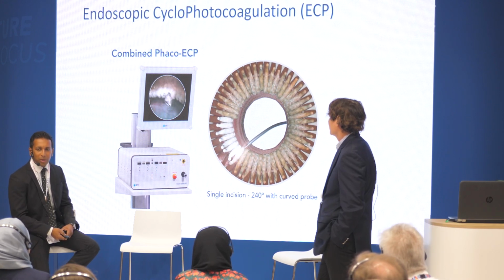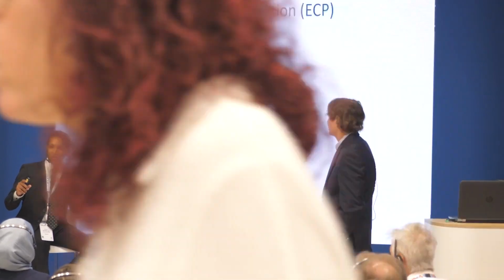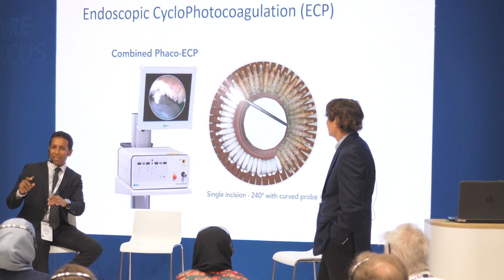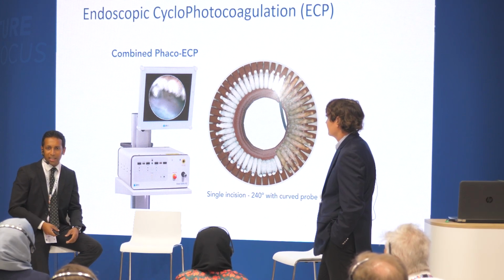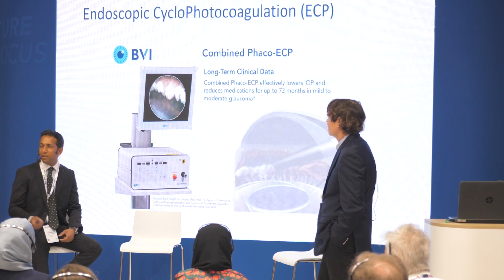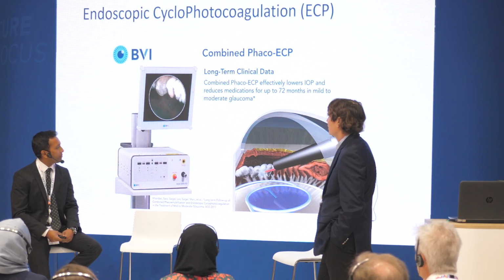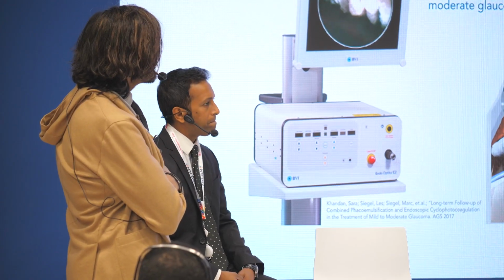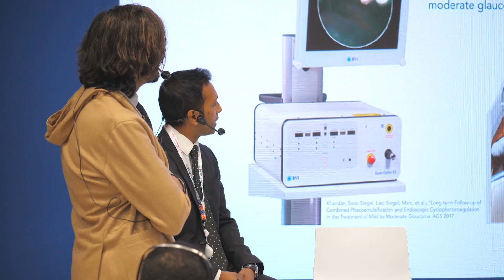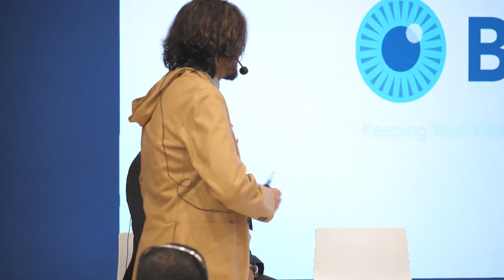It's not a difficult treatment, but you have to get used to not looking through your microscope and looking through the screen. So you're looking in that direction. I think the muscle memory can take a few cases, but once you've done a few cases, it's very straightforward surgery, I think. So. Great. We'll speak more about picking the right patients, as well as a bit of technique modifications, and also some of the special cases and risks and associations with that.